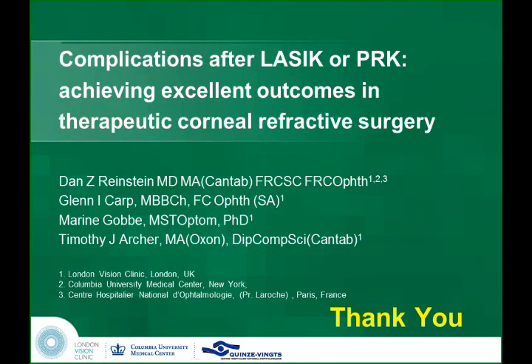No. Polishing with the wet is for things like microfolds and bits and bobs sticking out. So it's usually microfolds, and it's an extremely effective treatment. Paolo has, I forgot the name of the substance, which has the same ablation rate as stroma, and he puts a drop of that on, and whatever that liquid is, treats like a masking agent. I find that for microfolds, it's far more effective and easier to just flood the cornea and ablate until you can start getting breakthrough, stop, flood it again, and ablate, and dry it, and then check. And you saw in one go, it was like an eraser. It was like an iron, just going over it.